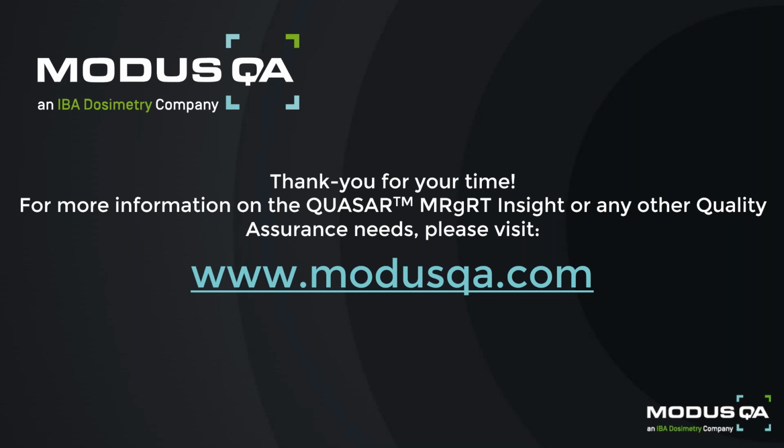And from our experience with different users in the past, not only with the Insight, but all of our other products, we haven't really faced any ion chambers that we couldn't drill or fit in so far. But in summary, if you have a specific ion chamber you want to use with the Insight or the insert, from our experience, it's likely compatible and you don't have to worry about that. So hope that answers your question.